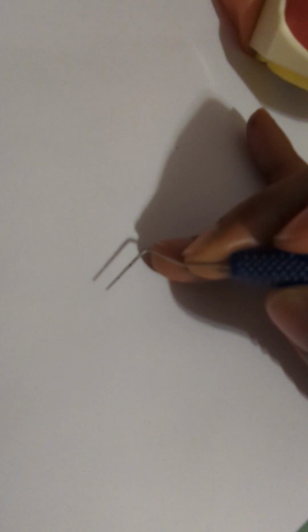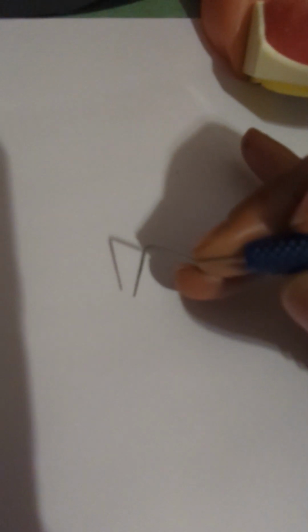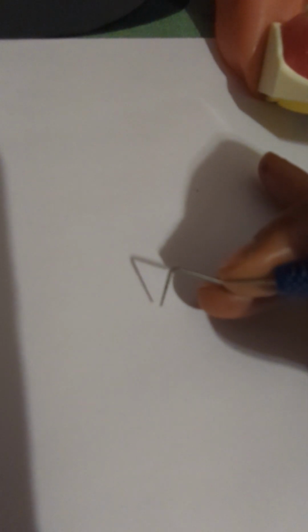Now, when you are probing, you must have a light grasp. You do not want to hold the instrument tightly. You want to hold it very lightly as you move it along.